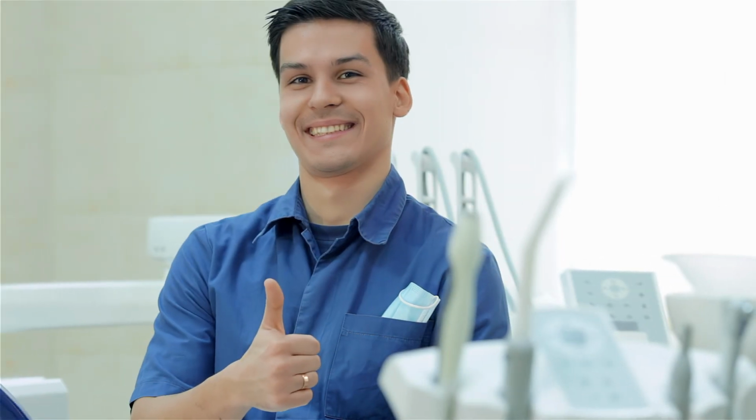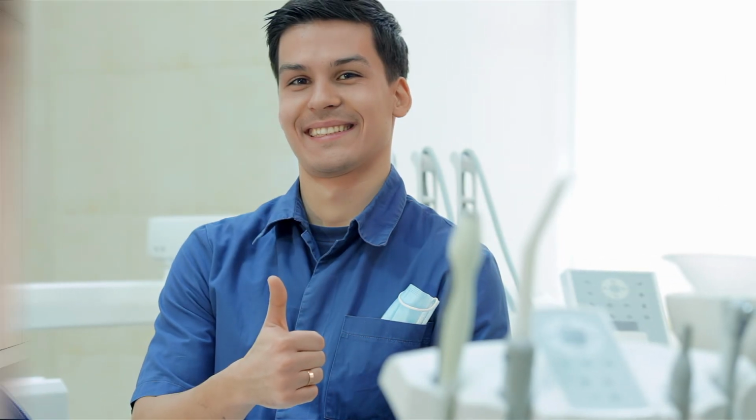Clinicians all over the world are coming at peace with the fact that soft tissue is very, very important in the durability of the implant. It contributes to the durability of the implant in a big way. It's as important as your hard tissue.